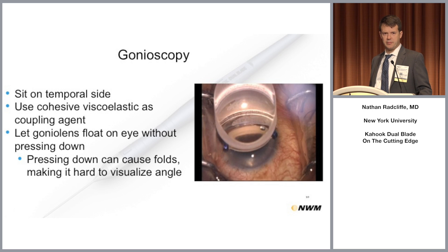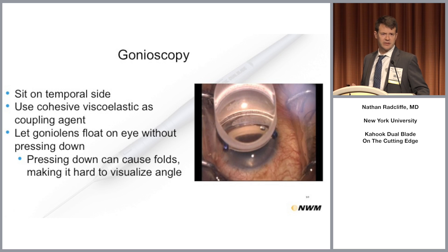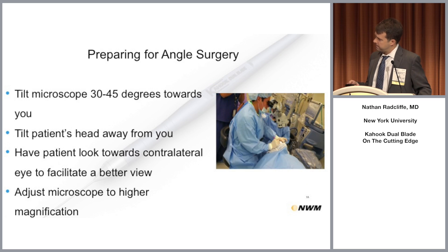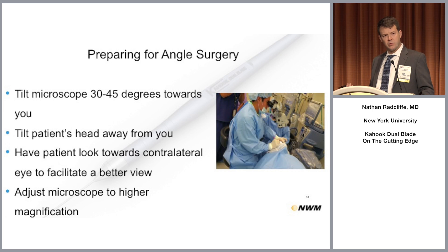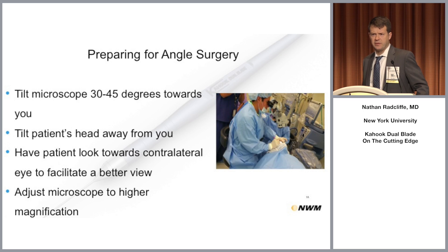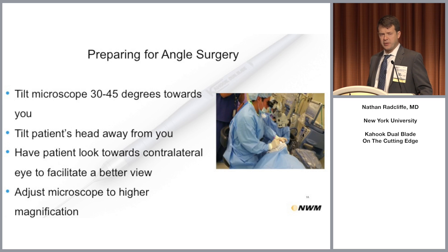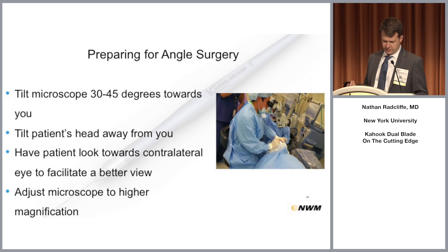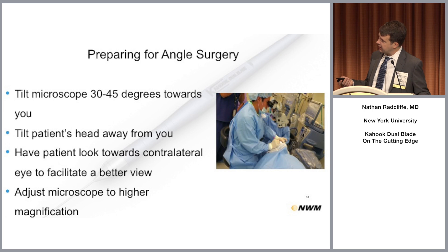If you see folds, it's either because there's not enough viscoelastic in the anterior chamber or you're pressing too hard with the gonio prism. Have the patient look away from you. I do this surgery under retrobulbar block or topical — if topical, I'll put some intracameral preservative-free lidocaine in the eye. The patient's eye can move, which can be good or bad. You want nice high magnification to see what you're doing.